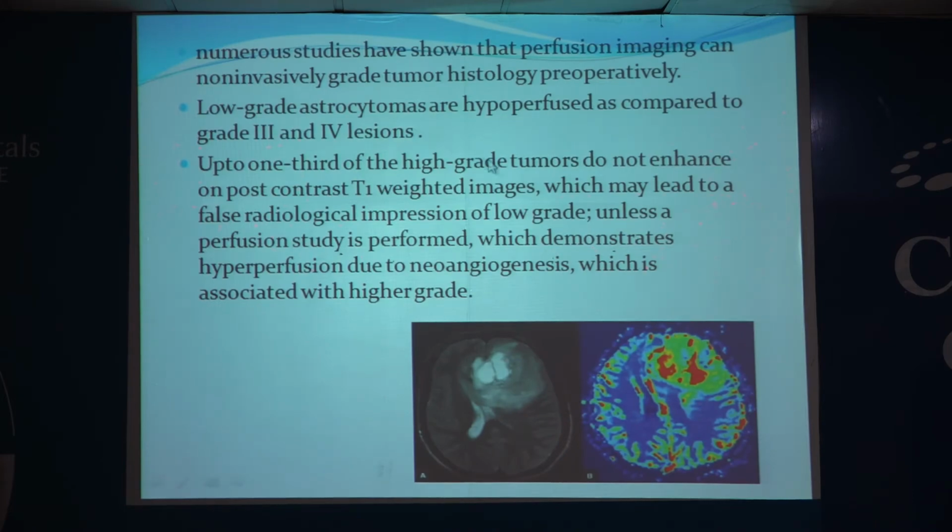So on post contrast, some tumors, even high grade tumors, might not enhance, which may lead to a false interpretation of a low grade tumor, but these perfusion studies will help us demonstrate hyperperfusion, which is usually associated with a high-grade tumor.